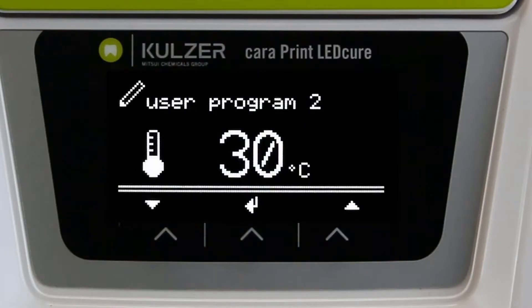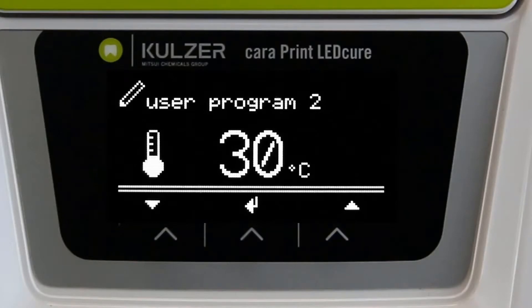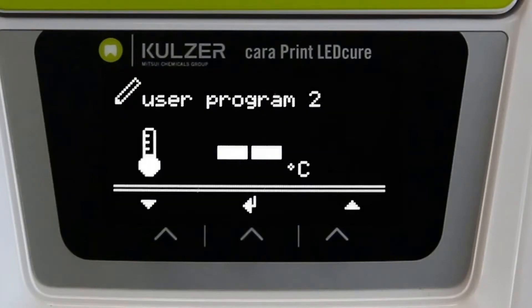Secondly, the temperature in the exposure chamber is set. This can be programmed between 30 and 80 degrees. If no temperature is entered, two dashes appear in the display and the unit starts polymerization at room temperature.